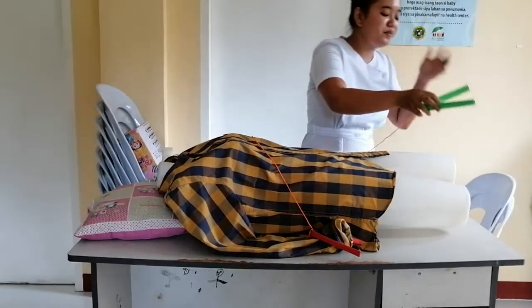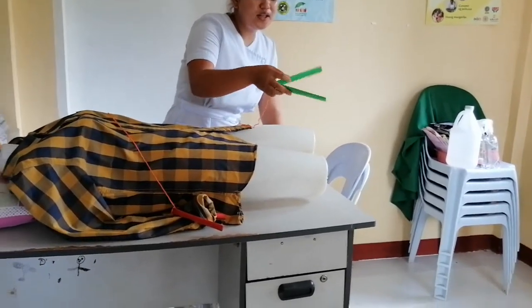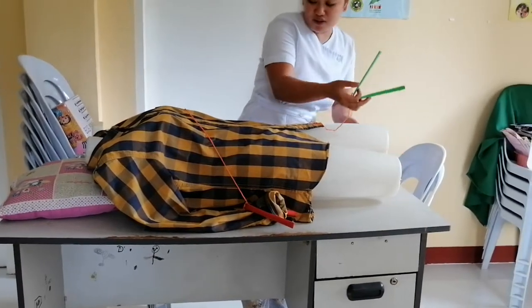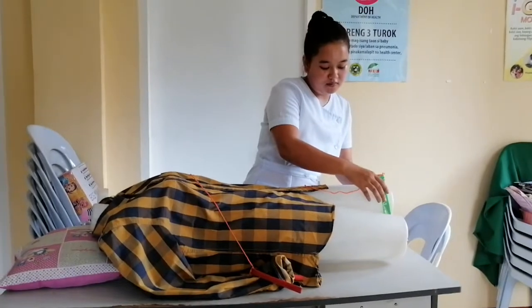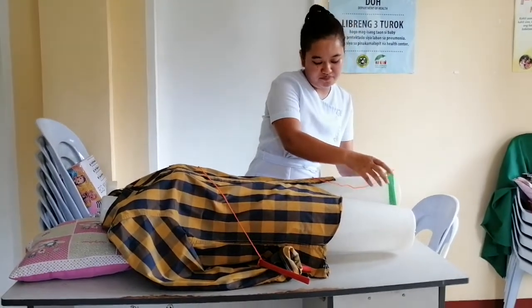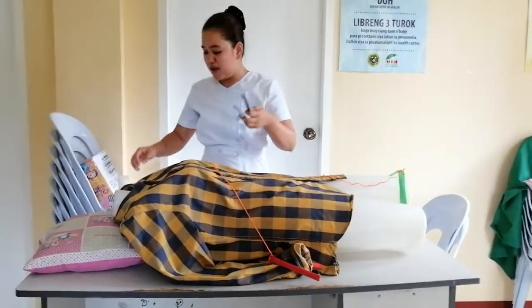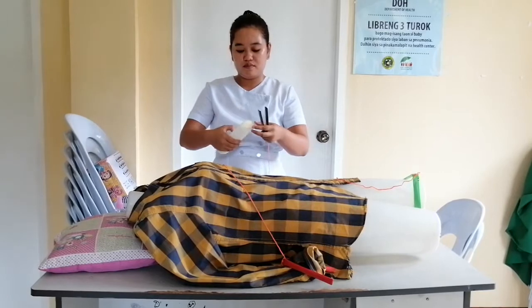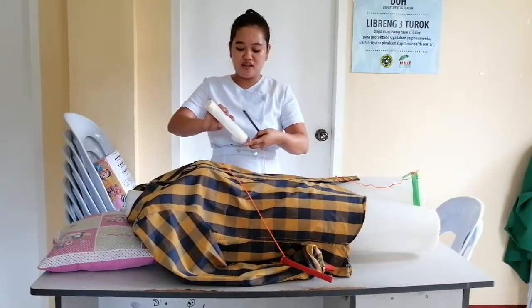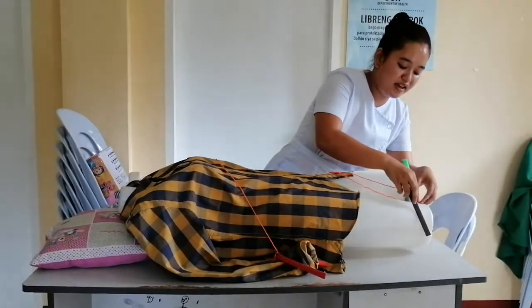So just assume that I'm going to place this limb lead on the left leg of the client. So where's the left? Here. And the black one to be placed on the right leg of the client.